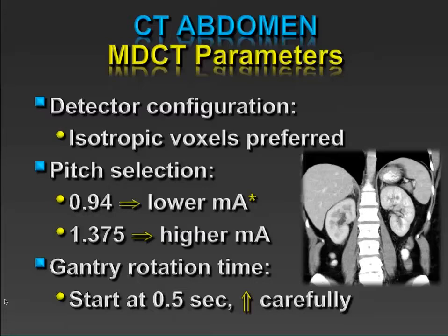Now, the coronal reconstructions are not isotropic themselves in that we use 3 millimeter thick slices in the z-axis, and that's what we do to get the noise down, because they look noisy in the axial plane, but they don't look noisy in the coronal plane simply because they're non-isotropic in the coronal plane. And we did an experiment a few years ago where we reconstructed coronals at 1 millimeter, 2 millimeters, 3 millimeters, 4, and 5, and a wide variety of reviewers settled on somewhere between 2 and 3 millimeters, and that's why we come up with that number.